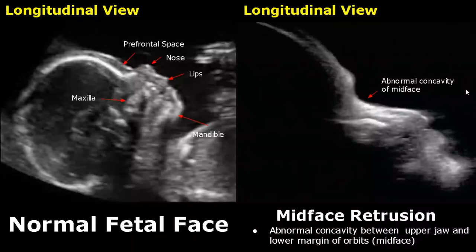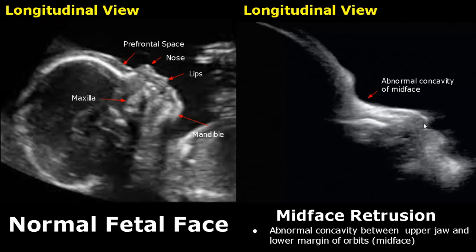The midface is the area between the upper jaw and the lower margin of the orbits. In midface retrusion, an abnormal concavity is seen between the upper jaw and the lower margin of the orbits. It is associated with a variety of abnormalities such as Trisomy 21, Turner syndrome, and many other syndromes.